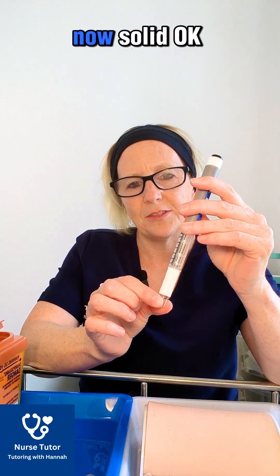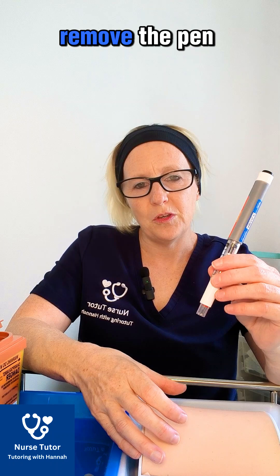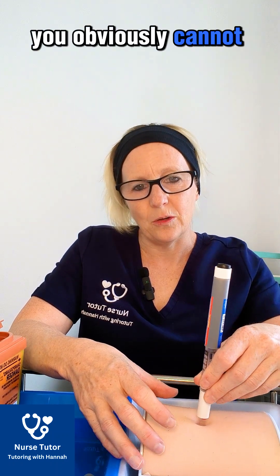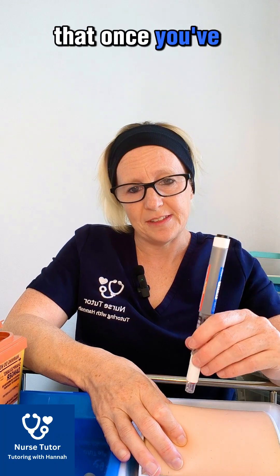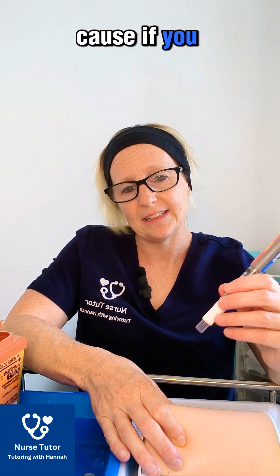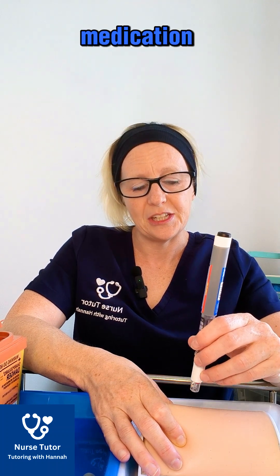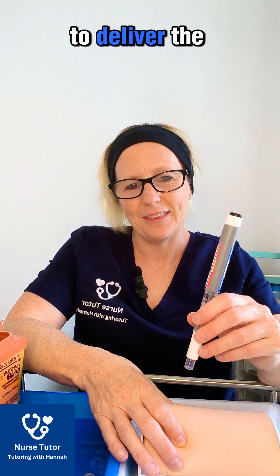The needle is now solid and protected by the safety cap. Once you've removed the pen you cannot go back into the patient. In your exam, be really careful — once you've inserted it, keep it in there and deliver the full medication, because if you accidentally remove the pen before administering the full amount, the safety cap will go over and you won't be able to deliver the medication.